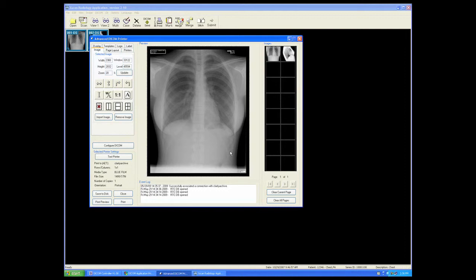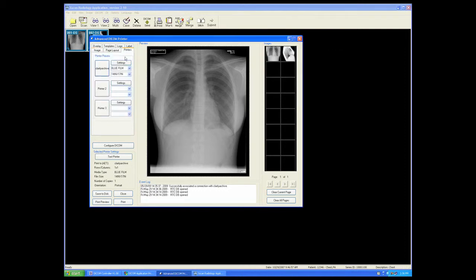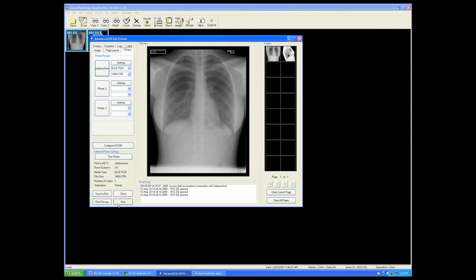Once we've set everything up the way we want, from the printers tab, make sure that the printer or the printer drawer is selected that we want, and select print. And then we have the event log down here documenting what has happened.